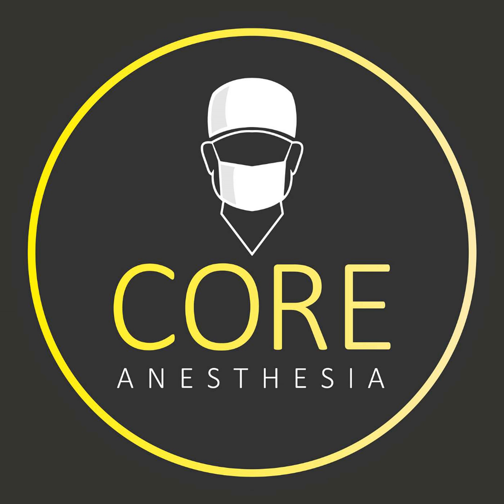The other thing is a lot of times, depending on what make of LMA you have, and I feel like this plays a huge role, sometimes that tip will want to flip on you, and then it won't want to follow the natural anatomy and go down, and you'll feel like you're really pushing. And so often you can reach back there if you're comfortable with it and flip that tip down, or you can just inflate it a little bit.